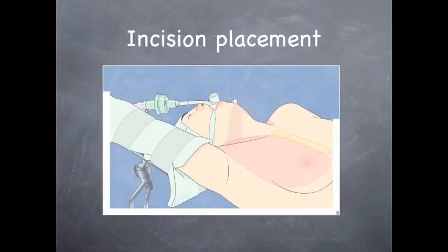For the endoscopic transaxillary approach, the arm is very carefully extended over the head to expose the axilla. The incision is then made in the axilla to allow access to the thyroid gland.